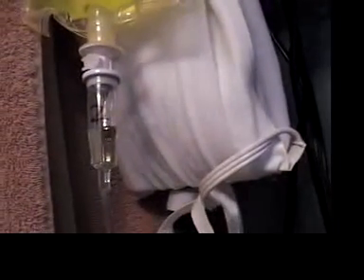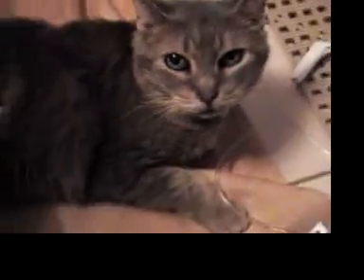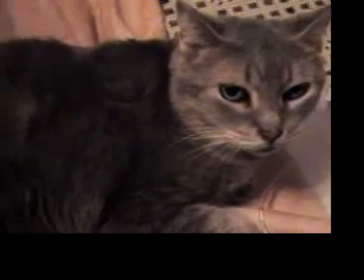That's pretty good flow. I'm using 19 gauge needles. The lower the gauge, the faster the flow will be. So 18 gauge is faster than 19 gauge, 20 gauge is slower.